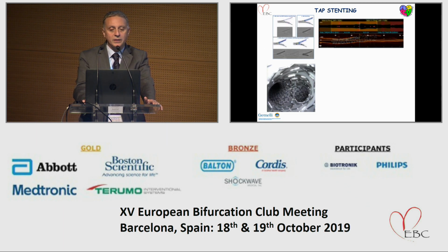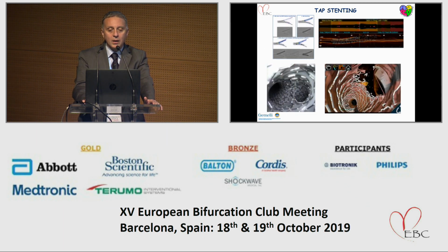And then you have the 3D reconstruction. You see here that there are limitations with 3D, even with the latest cutting edge, because it is evident that we may capture here the neocarina. You may see it. It is not so long, but it does exist, and you capture it. The problem is that the automatic machine algorithm to allocate the stent and recognize the stent struts starts making errors because the geometry of the stents is not recognized. So there are limitations when you go with a very complex technique.